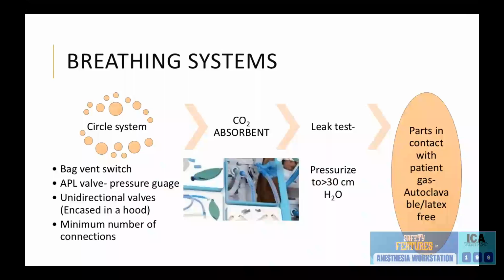I'll just touch upon the breathing systems. See, the circle system has its own inbuilt mechanism.